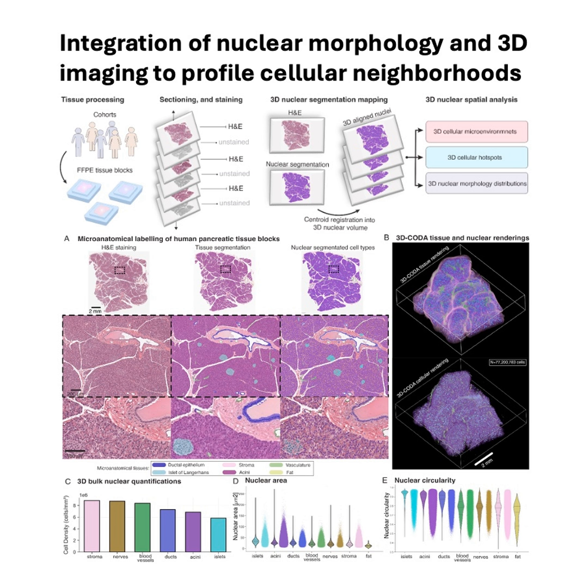Precisely. And the first big computational step was aligning them all perfectly. It's called nonlinear image registration. Okay, registration, what does that involve? Think of it like this. You have these hundreds of digital slices, maybe slightly warped or shifted from the slicing process. Registration is about meticulously aligning each 2D slice with pixel-perfect precision, correcting for any distortions. So you're digitally restacking them. Exactly. You're digitally stacking them to perfectly recreate the original 3D tissue block, like digitally rebuilding that loaf of bread, slice by slice, but perfectly aligned. The result is a seamless, high-resolution digital 3D volume.